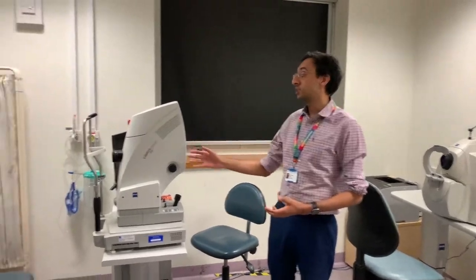The RCO and NICE guidelines recommend that all patients coming for virtual appointments have a 45-degree true colour fundus photograph, which can be undilated, and for this reason we use the Cirrus Photo 600 to take the colour photograph, and this can be used in conjunction with the OCT and the vision to determine if the patient needs any change to their treatment.